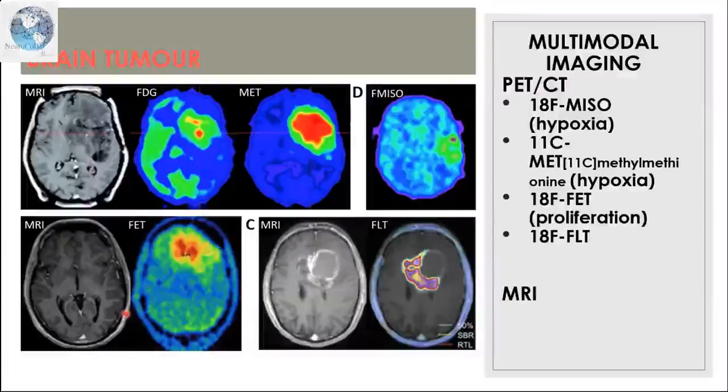Okay, then we go to brain tumor. Okay, brain tumor ni kerana dia agresif, dia akan guna glukos dengan banyak. So kalau kita buat FDG scan, dia akan lebih hypermetabolism, lebih tinggi penggunaan glukos. Tapi susah juga kita nak tahu berapa besar tumor ni sebenarnya. Banyak besar area yang menggunakan glukos, betul ke tumor tu that big. So that's why sometimes we do multiple radiopharmaceuticals to know more accurately.